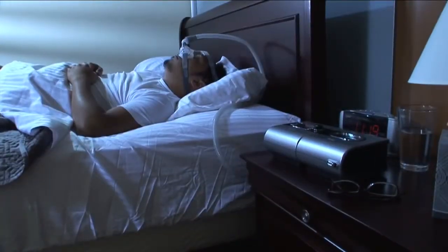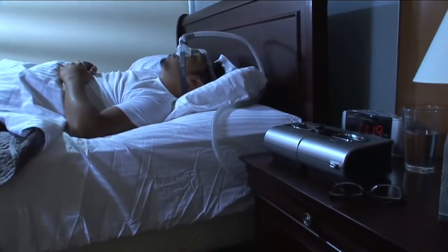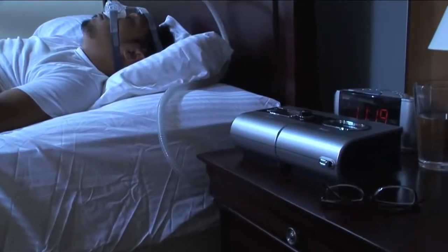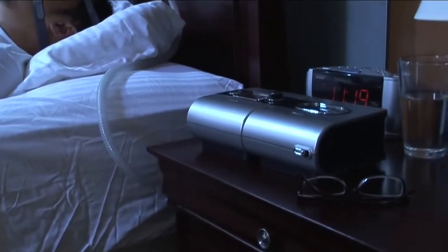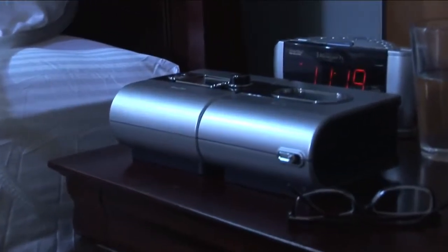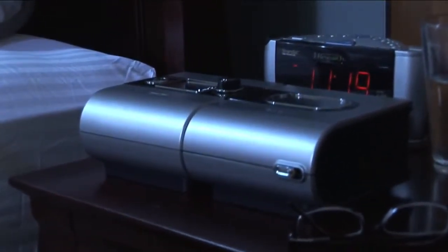Some family pets are attracted to the heat and vibration that is generated by these devices. It's important to make sure your pets don't sleep on or around your device. This could limit the amount of air flowing through the device, potentially clogging the filter and ultimately affecting therapy.